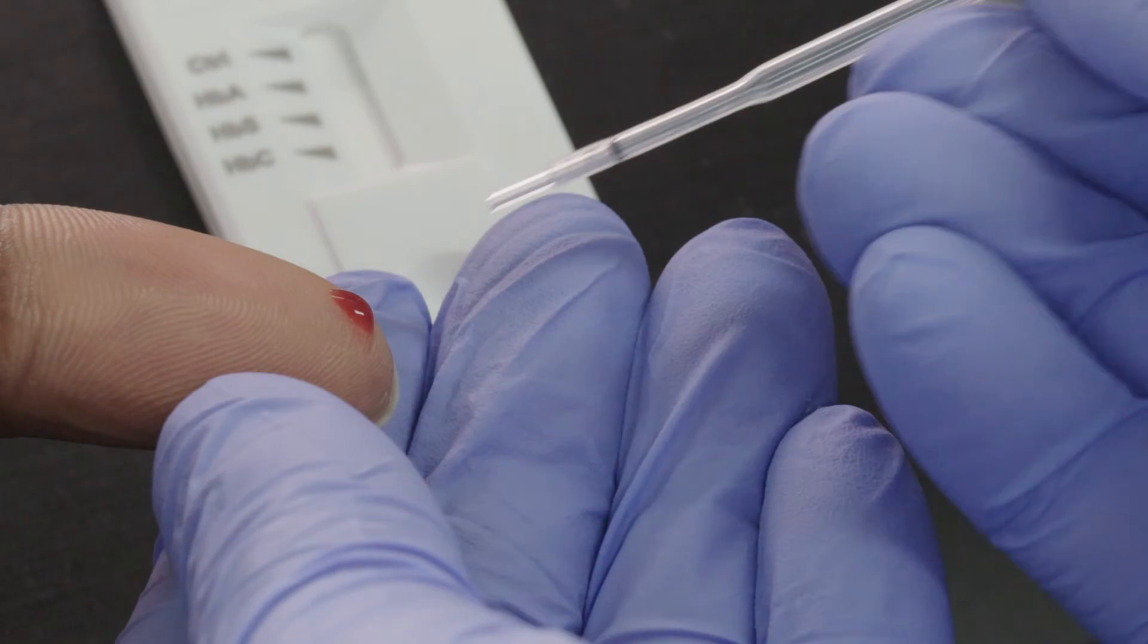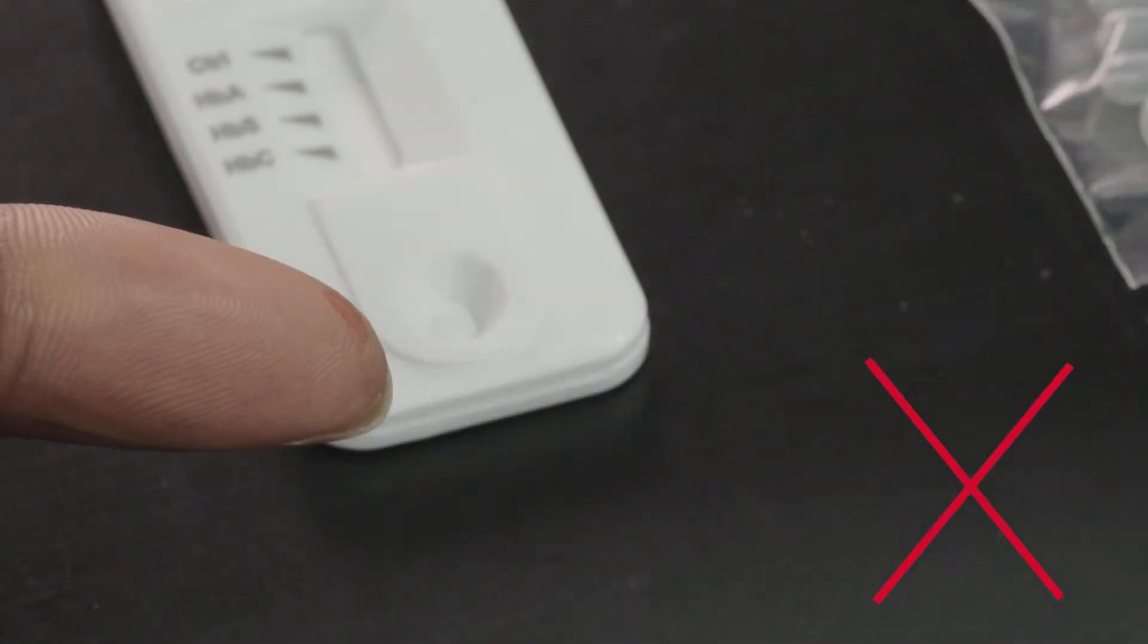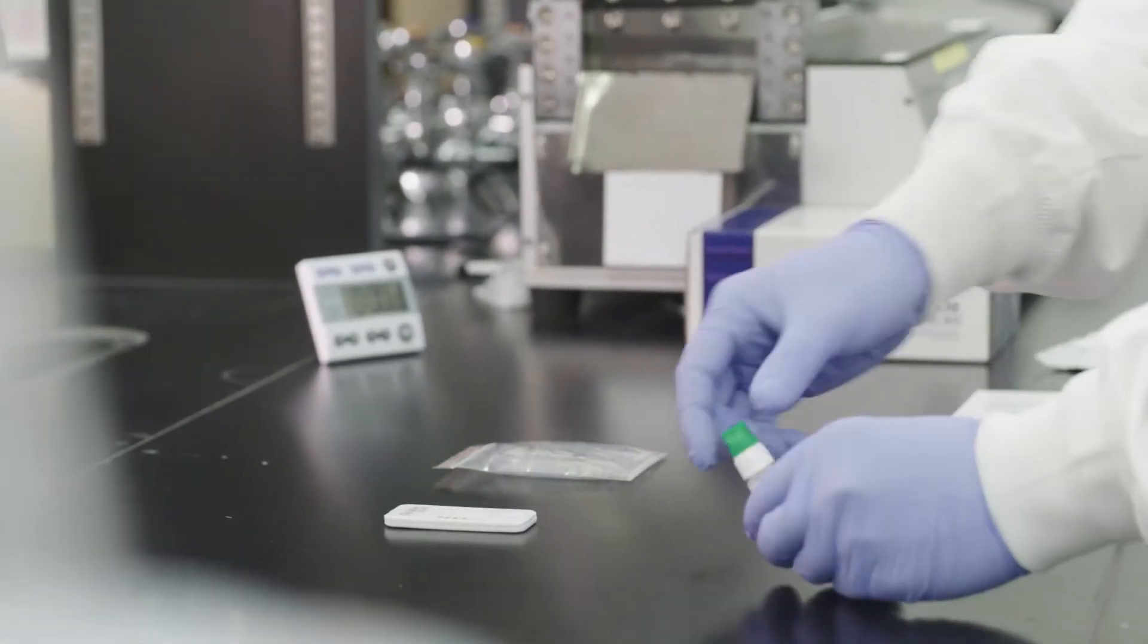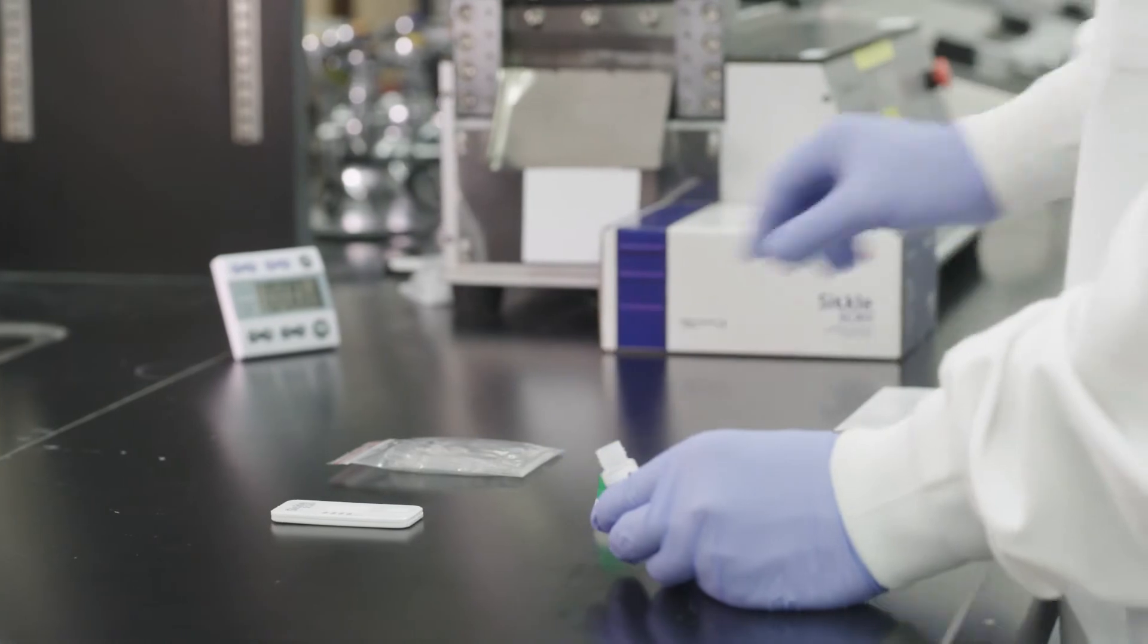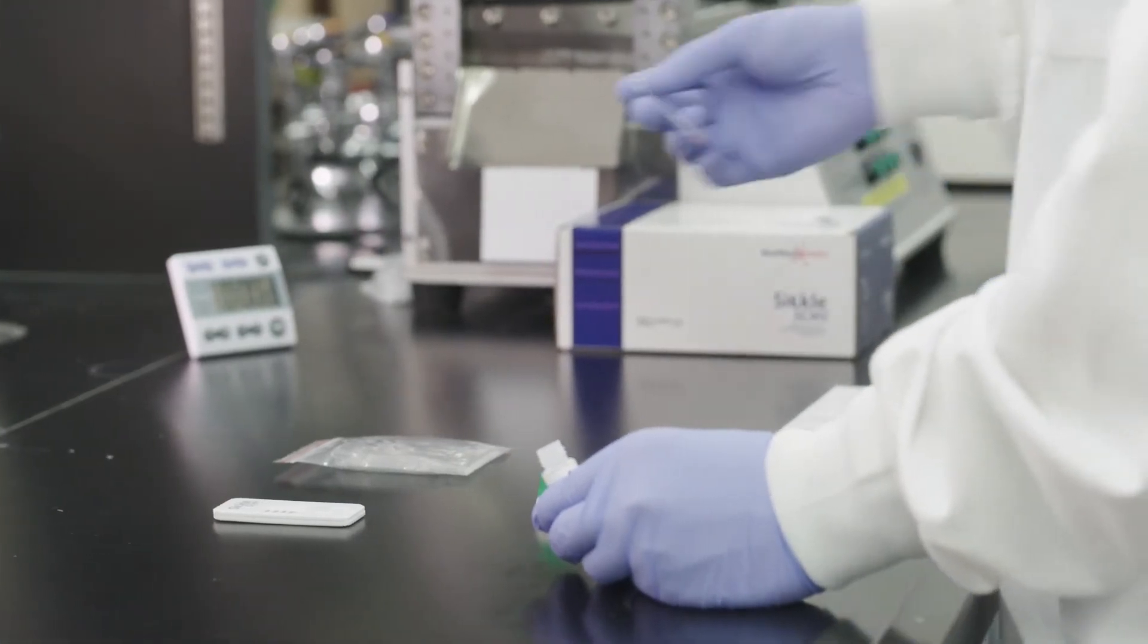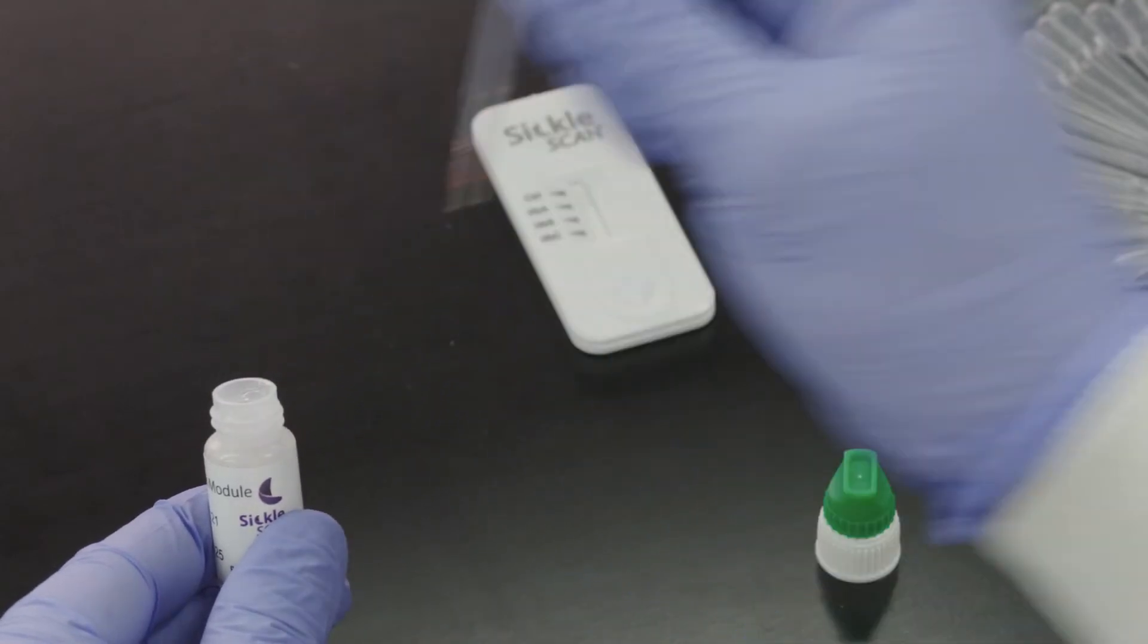Do not squeeze the sampler bulb, as doing so may aerate the blood, causing the sampler to underfill. Open the pre-treatment module by unscrewing the white portion of the cap, then immerse the sample tip into the liquid, release the sample, and screw the two-piece cap back onto the buffer.